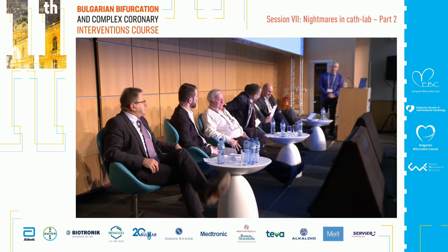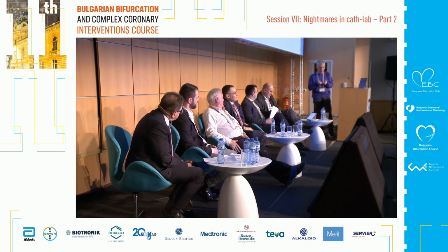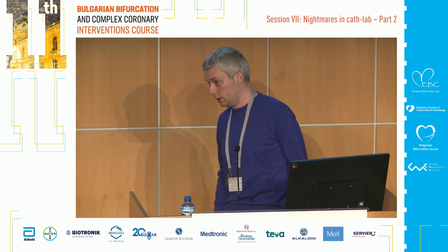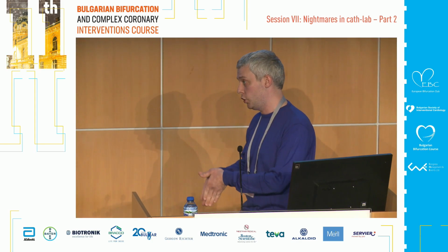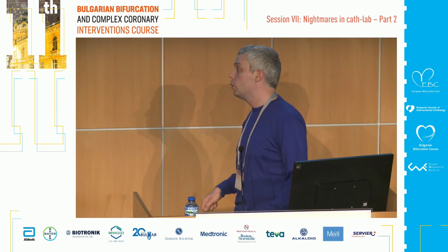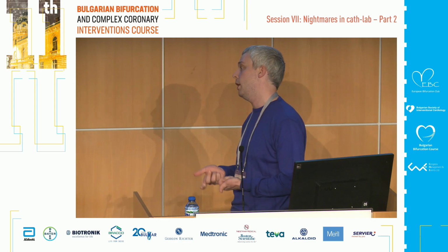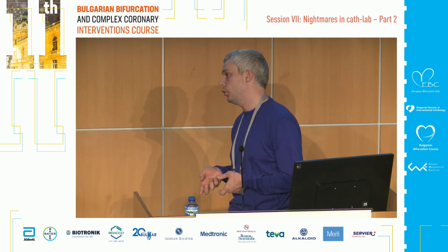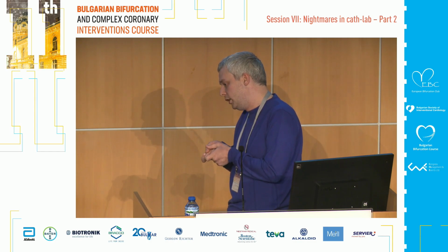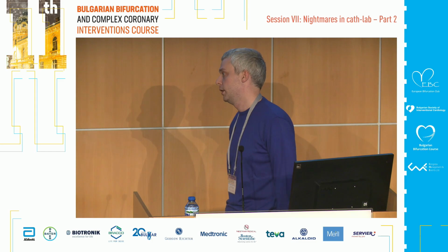To be honest, we have had 2 situations of pop-up of the valve during traction. Yeah, yeah. But this was not a patient with deep implantation or migration of the valve, but 2 patients with coronary occlusion just after implantation. So such pop-up was bailed out. Yep. In this patient, trying to just a little bit move the valve was unsuccessful, and pop-up happened.